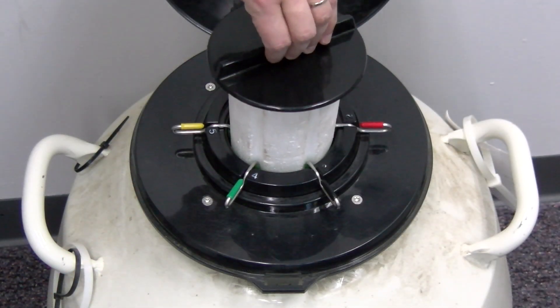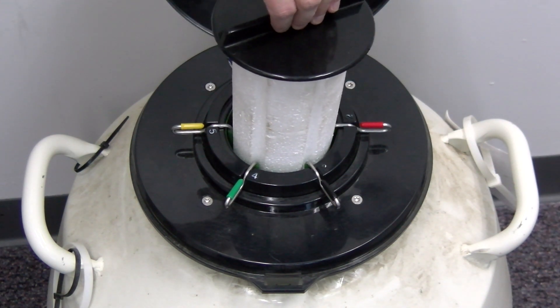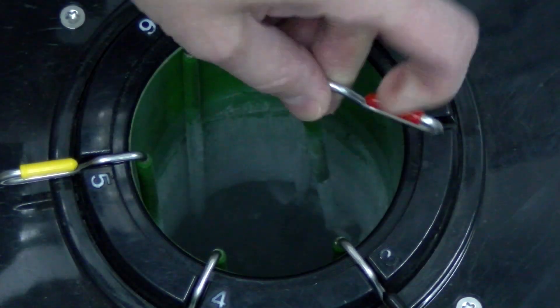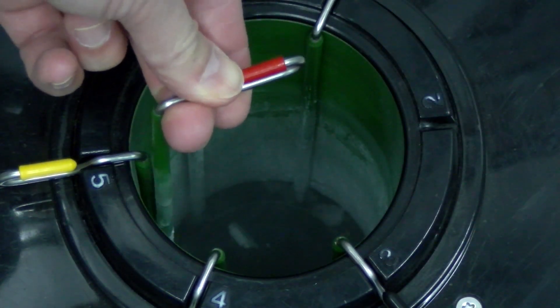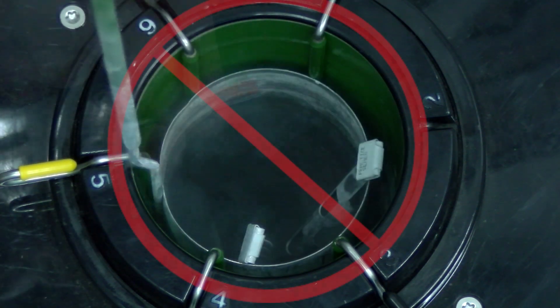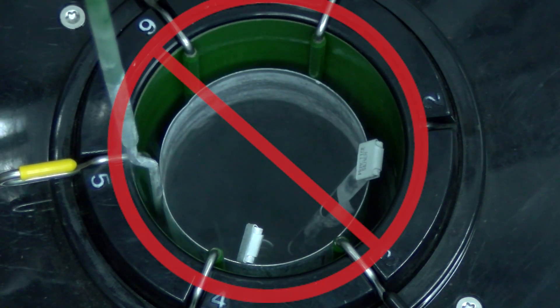Keep the neck plug in place and the lid closed on the tank until you are ready to retrieve the straws for thawing. Raise the canister until the cane tops are a few inches below the tank's opening. Do not raise a canister above the frost line.